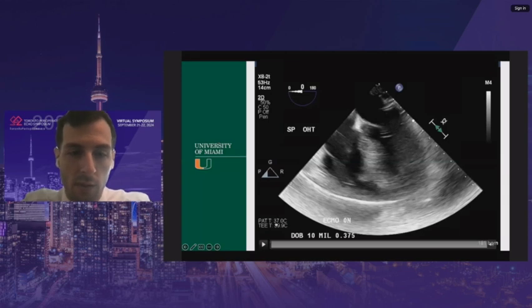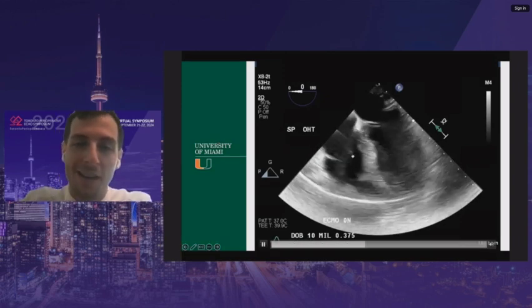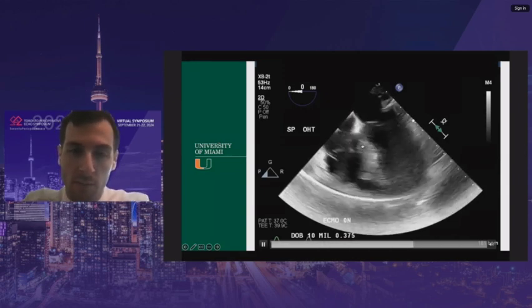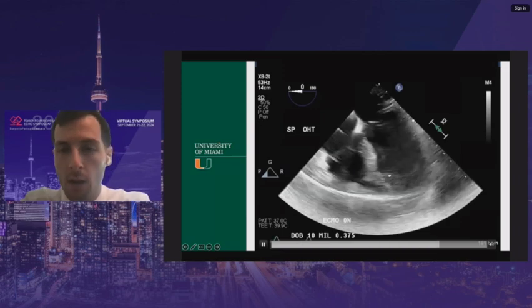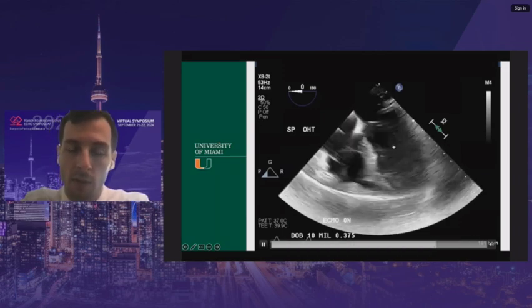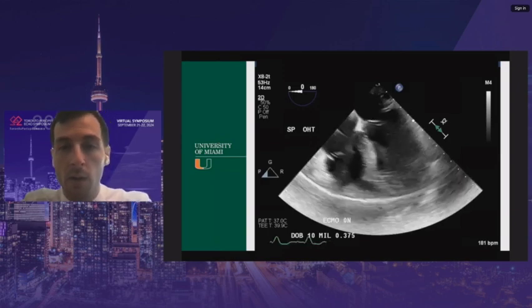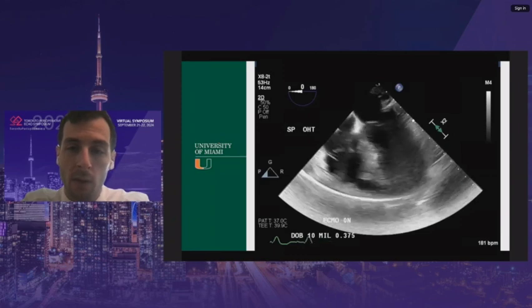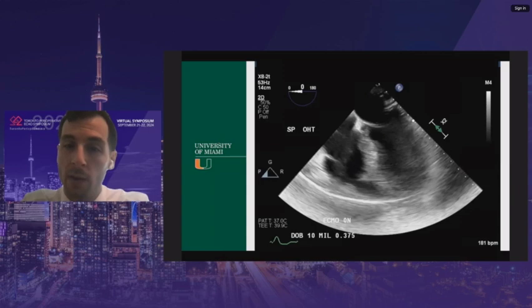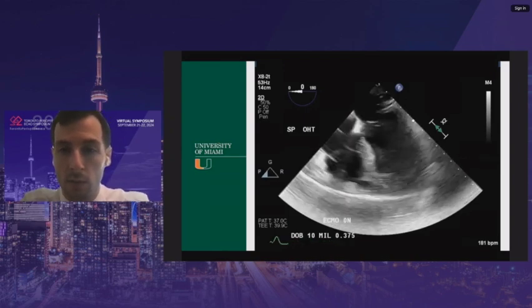Here's an example coming off a heart transplant. You can quickly tell this is not a great functioning heart — there's almost minimal RV function, possibly dilated. We were on significant inotropic support: dobutamine 10, milrinone 0.375, and then ECMO. In other views not shown here, the LV was actually starting to distend — so multiple problems: heart failure, mechanical support, and now LV dilation. Increased LV dilation increases cardiac myofibril oxygen consumption, creating a positive feedback loop with worsening function. We needed to offload the LV.